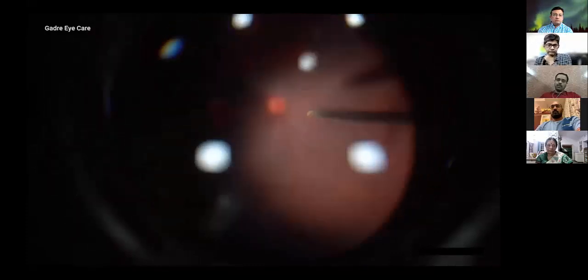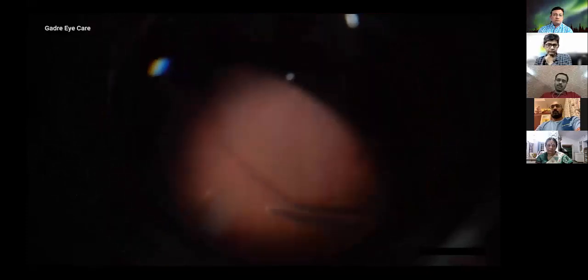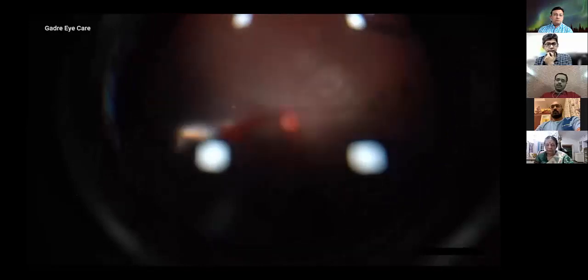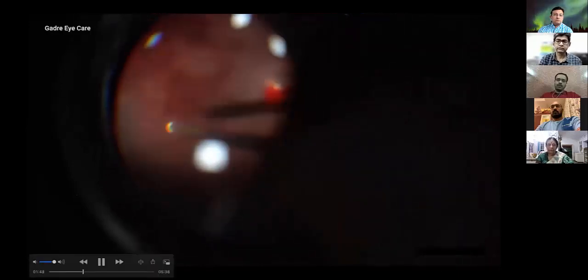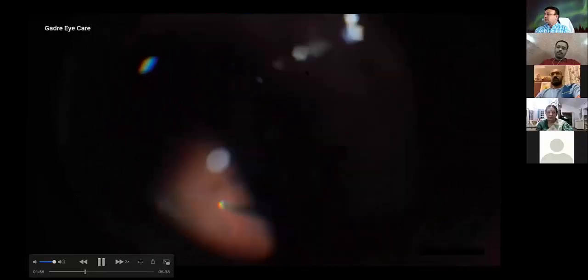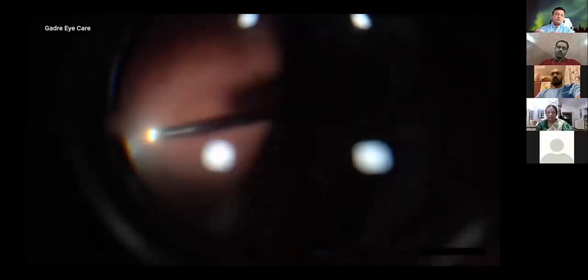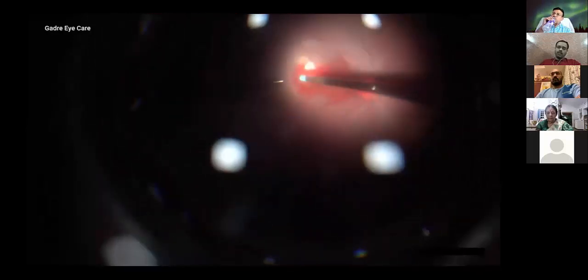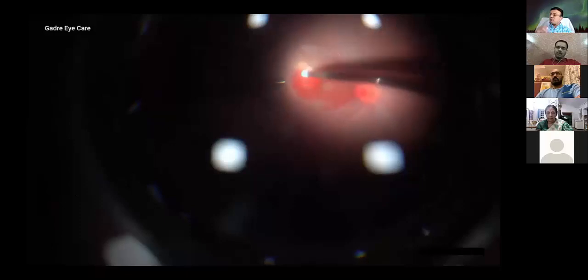One needs to be sure to go along the surface of the retina so as to not create any further traction on some weak points in the retina if there are. Further completion of the vitrectomy was done, including as much base shaving as was safely possible with the clear lens. Then came the main challenge.